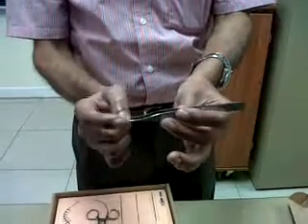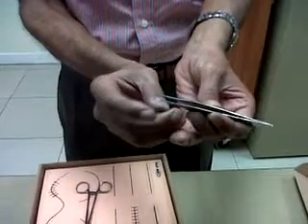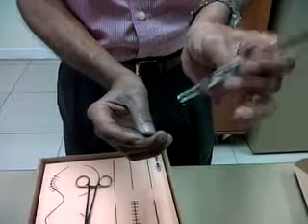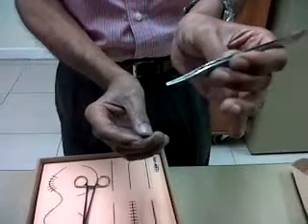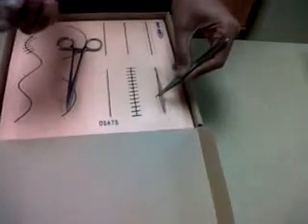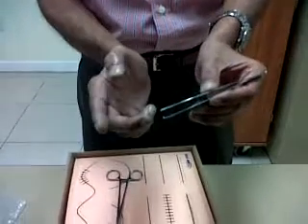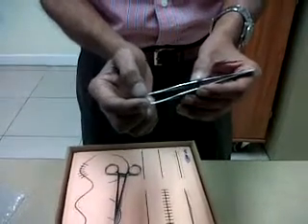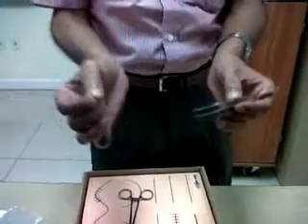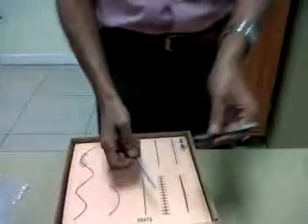The forcep is used to grasp the structure firmly between the two jaws. This is called a tooth forcep — it is used for structures like skin and other tough structures. The other type is the plain thumb forcep, which does not have the tooth, and we use those for delicate structures like peritoneum, intestine, and mesentery.